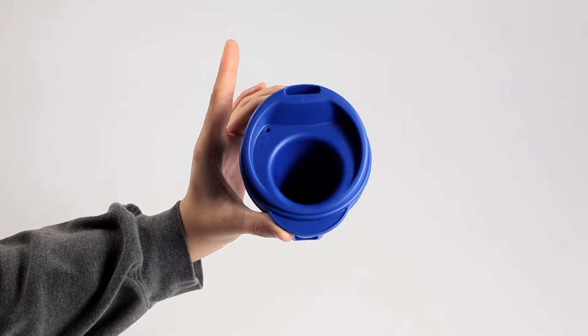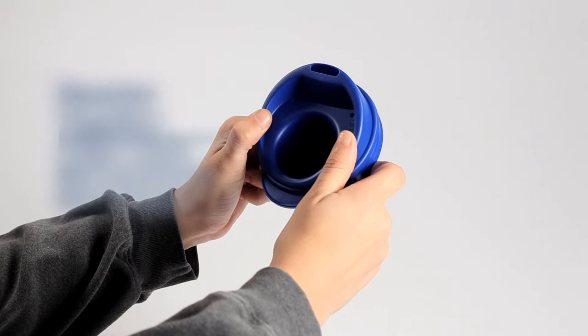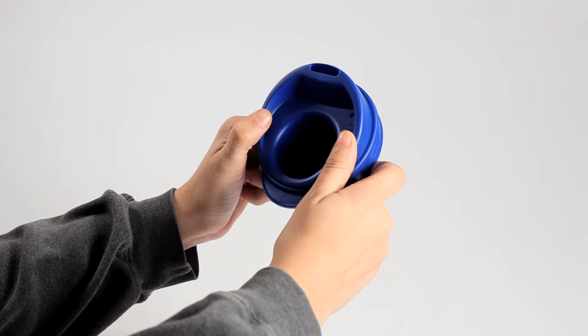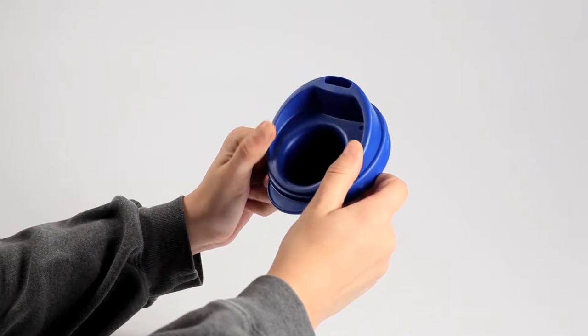Using both hands, place the aligned parts between your thumbs and first finger of each hand on opposite sides of the rim of the cup. Squeeze the parts together by applying pressure on the elevated rim of the top cup with your thumbs while squeezing under the rim of the mid-cup with your fingers. Avoid touching the drinking area. When assembled correctly, an audible snap should be heard.